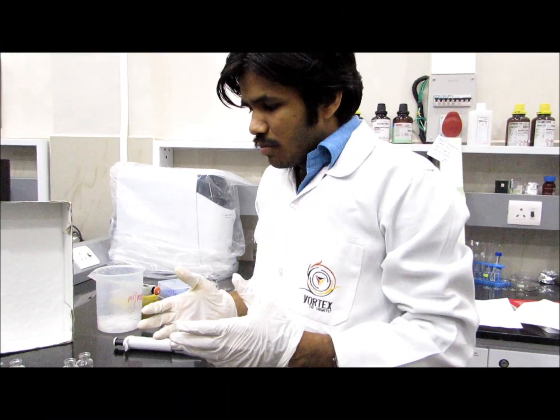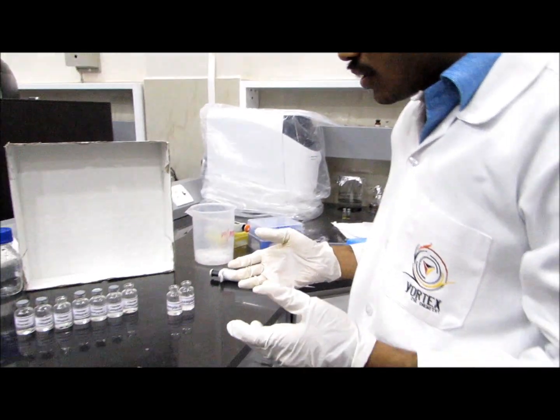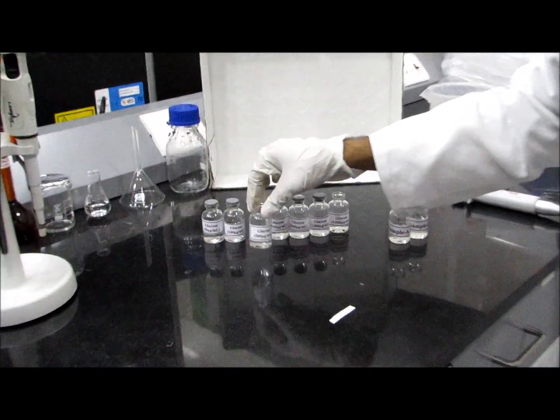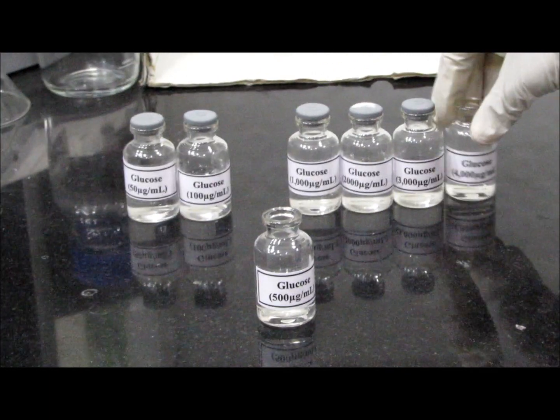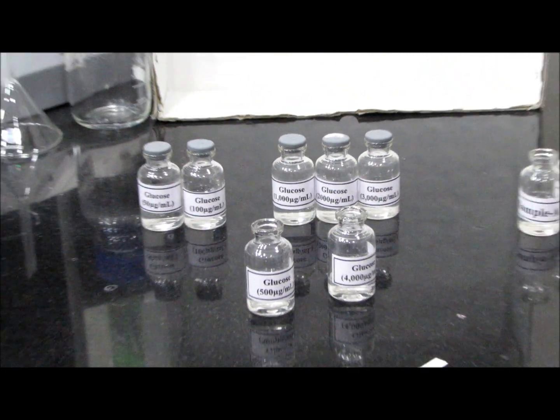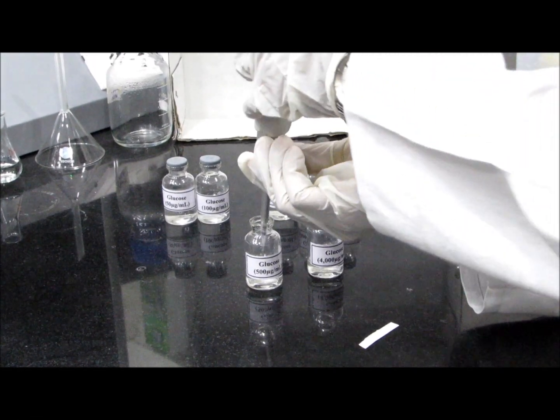Now this technology can be converted into strip-based technology. To check the strip-based technology, we are taking the same concentrations as before, 500 microgram per ml and 4000 microgram per ml. From this, I am taking 1 drop of this solution.